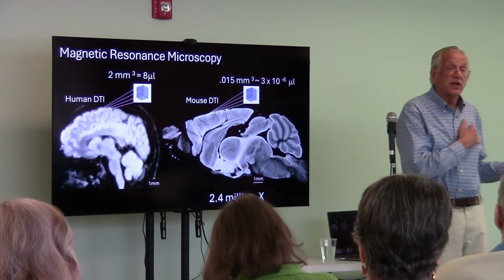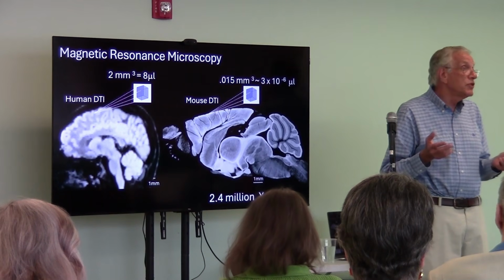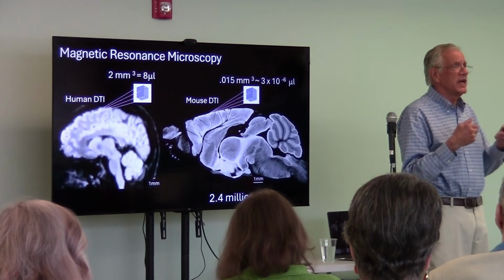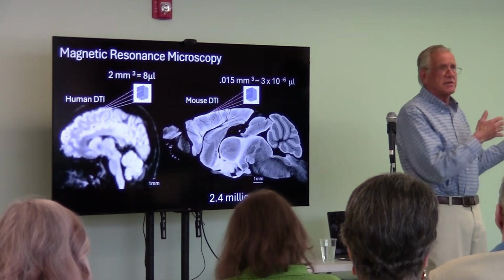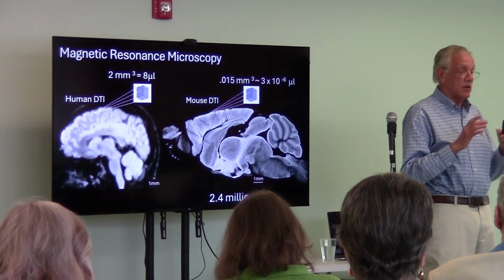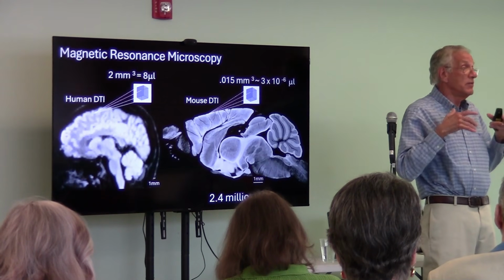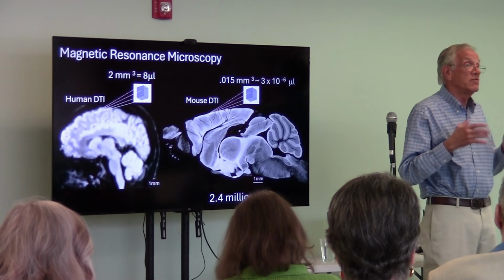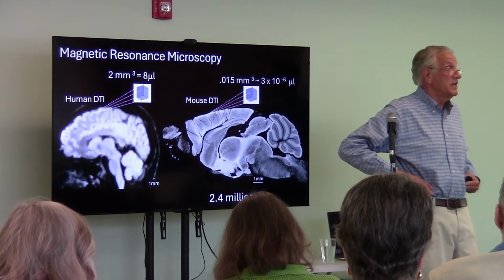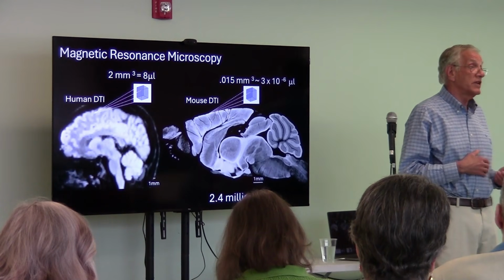So, the backstory here: when I started commuting back and forth to Milwaukee, I would commute 2 times a month. Like Ronald Reagan's book, I was told I was president. I was told that I had children. I was in O'Hare many, many times. Early on, we could only make the radio frequency coils that big. So we would scan my brain in the morning, and in the afternoon, we would scan Rags the Wonder Dog, because we needed to be able to see the liver. We needed to be able to see the kidneys. The expectation was you would not be able to see them at 1.5 Tesla.